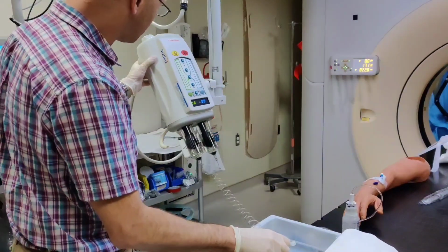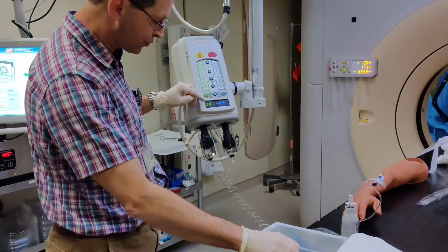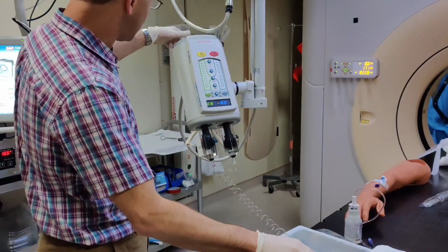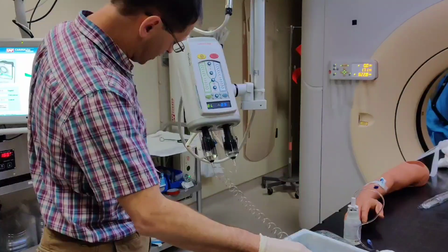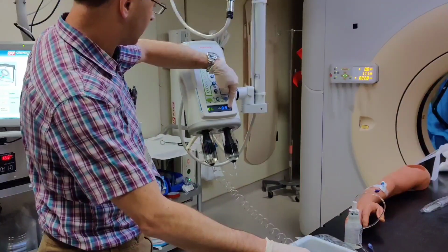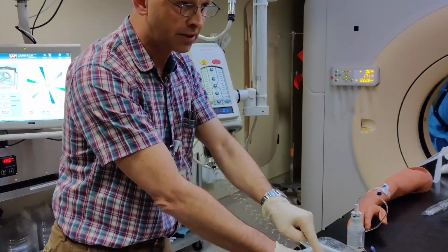The first thing I'm going to do is inject about a mil or two of contrast into the line to fill in a little airspace here. So I've got 80. If I do, I'm going to go maybe 2 mils. And the next thing I'm going to do then is inject saline into the line until I've got saline coming out of the end here.